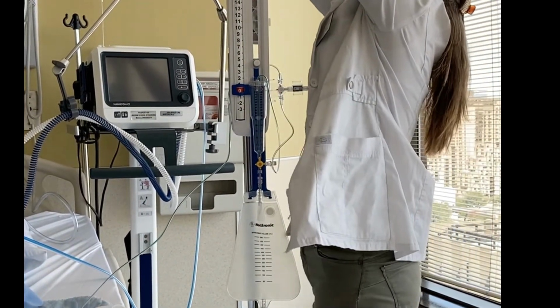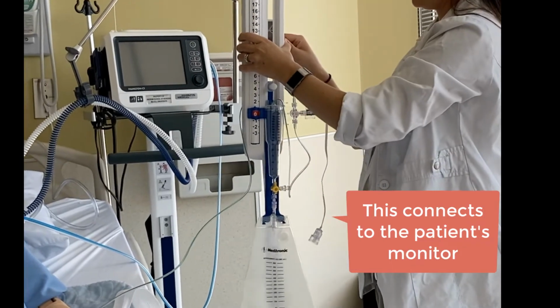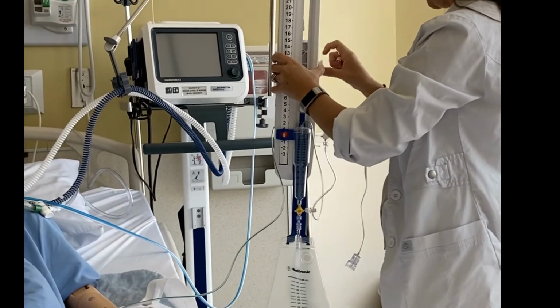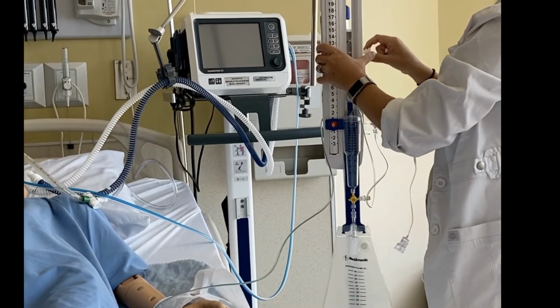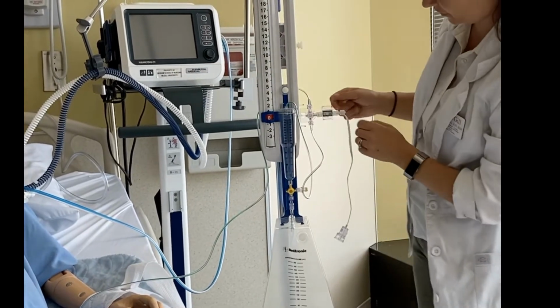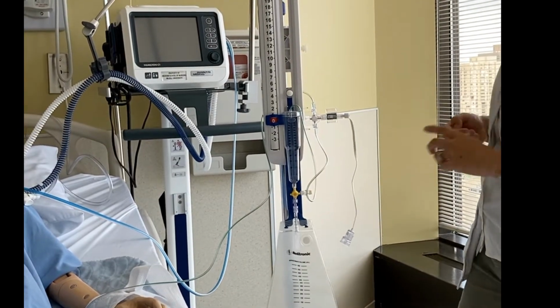If not, I can move the system myself. So let's say if I look at my patient now, I'm way too high. So I will have to lower my system until my little laser pointer is shining towards the external auditory meatus or the tragus. I can also raise the bed so that the patient is more aligned with my transducer. Once the system is leveled, you can start measuring your ICP.